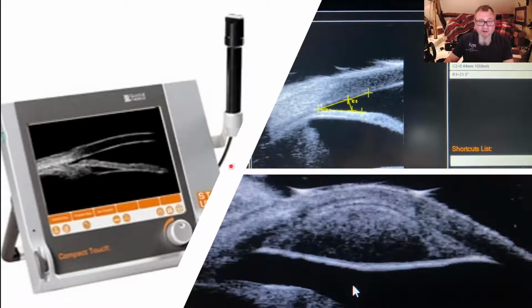But we also have incredible ultrasounds nowadays. This is an ophthalmic ultrasonic biomicroscope, 50 megahertz. It allows us to see Descemet's membrane and individual cells in the epithelial layer. This is actually an iris corneal cyst, an epithelial inclusion cyst. We can image within the corneal stroma itself. We use it occasionally for things like this lump, more often for looking at the drainage angle and the ciliary cleft to try and understand more about glaucoma, which is our most difficult disease to manage.